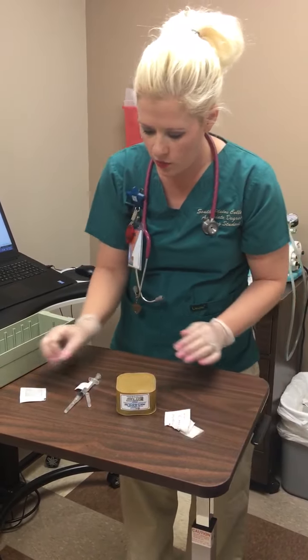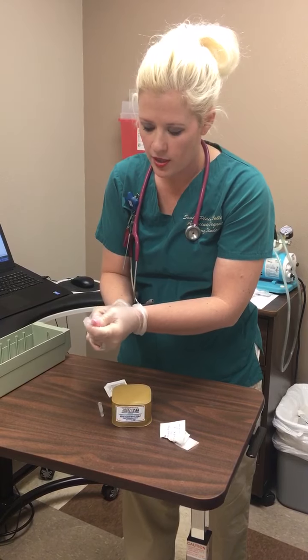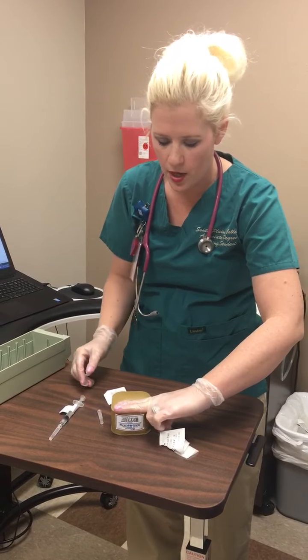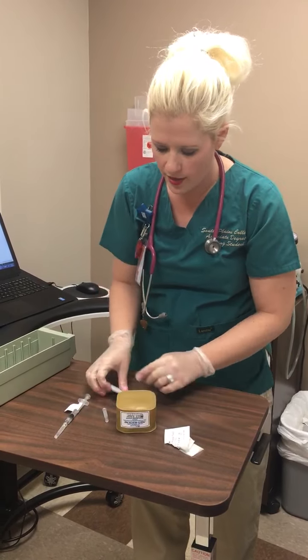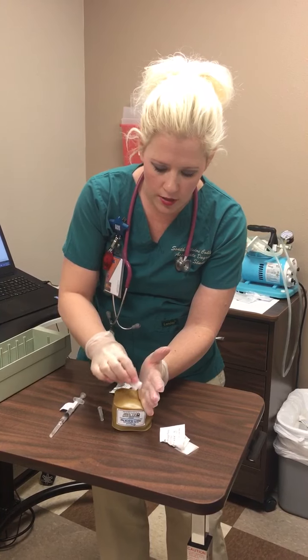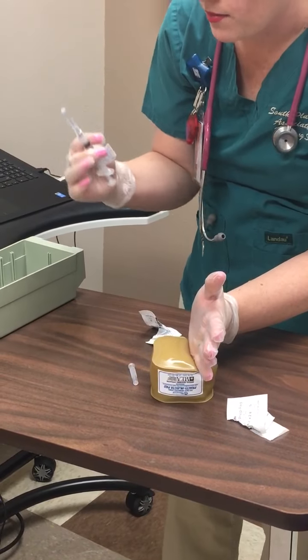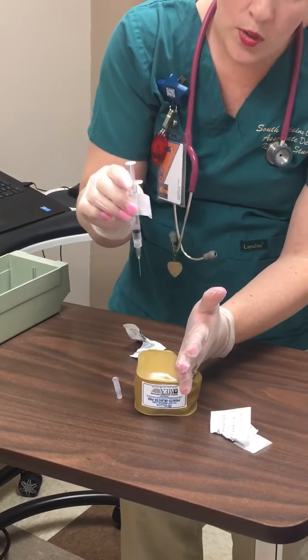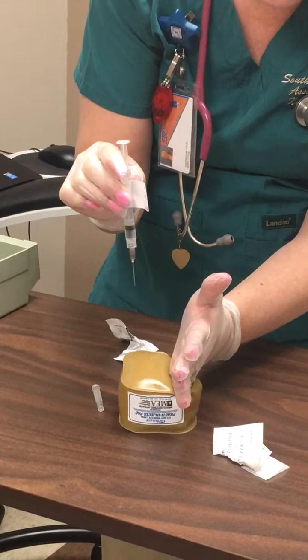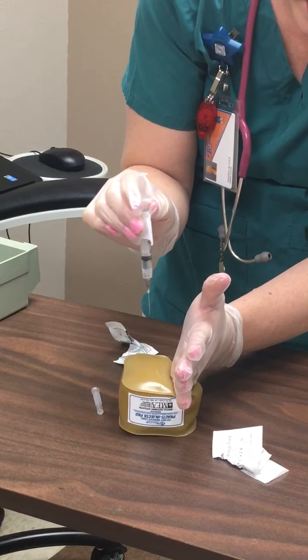Okay, we have one more injection for you, Mrs. Smith. Okay, this is a sub-Q, or I'm sorry, an intramuscular injection. It is our influenza vaccine. We're going to go in the deltoid, so I'm going to measure my spot and make sure I identify my landmarks. Okay, I'm going to Z-track over, start in the middle of my alcohol swab, and go out. I'm going to take my medication, drop my lid. I'm going at a 90 degree angle. Because this is an influenza vaccine, we are not going to aspirate. All other injections that are given IM, we are currently aspirating, so we will not aspirate with influenza vaccine.